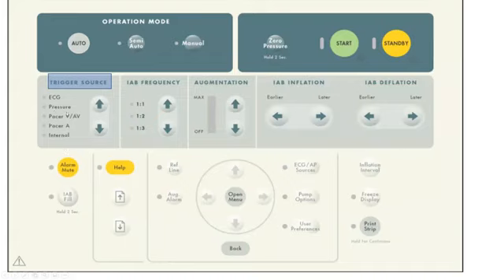It can use the pressure to trigger, meaning it looks at the dicrotic notch and it inflates on top of it, and it deflates just before the arterial pressure rises. However, this should not be used. It's preferred to use EKG because when you use the pressure, the inflation and deflation are timed to the length of the preceding cardiac cycle.